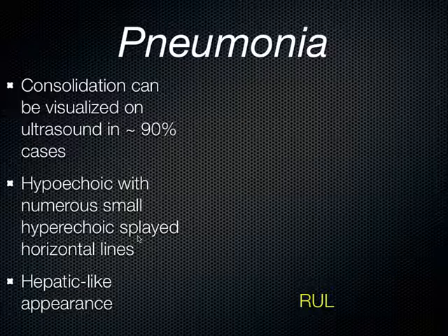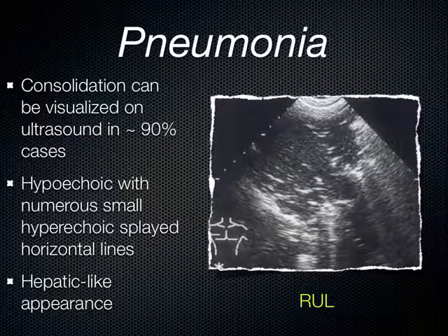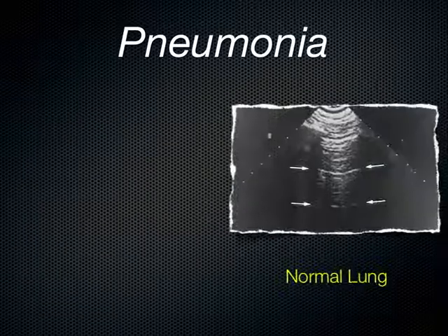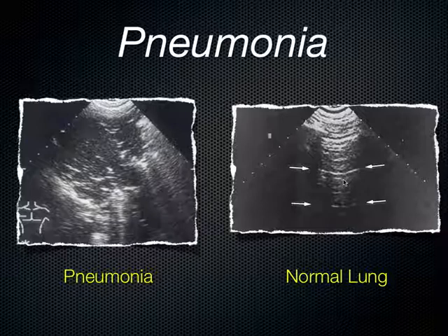A consolidation or pneumonia can be seen on ultrasound in up to 90 percent of cases. What you see is a hypoechoic area in the chest with numerous hyperechoic horizontal lines throughout — it actually looks like the liver. The term sometimes used is hepatization of the lung. You can see the difference between normal lung with repeating A-lines from the pleural line versus losing those A-lines and seeing a consolidation or hepatization.